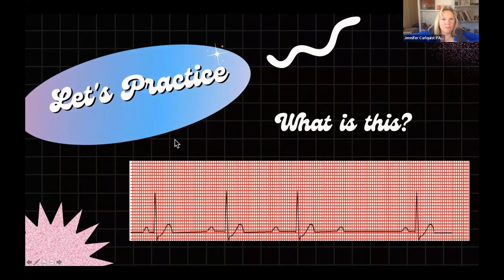And then we have a couple more for you here. What's going on here? Yes, you guys are all over the MAG. I love it. What is going on here? So this is a problem in the marriage between the mom and the dad. Okay, this is a problem in the marriage. I'll tell you if it's a heart block. Okay, yes, actually you guys already got it. You guys already said Wenckebach. Okay, good. You're right. This is a Wenckebach. This is a second degree type 1.